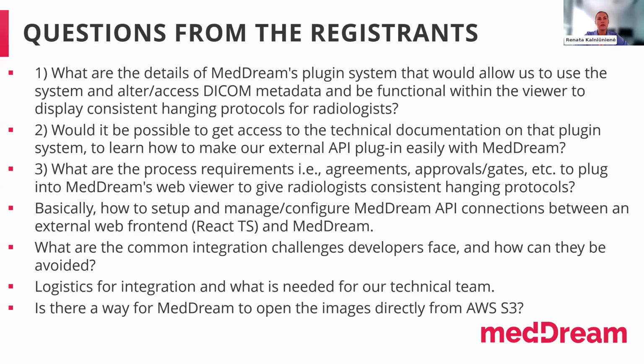So another question: what are the process requirements, agreements, approvals, gates, etc. to plug into MedDream's web viewer to give radiologists consistent hanging protocols? I would say it's a similar answer to the first question. MedDream has its own hanging protocols. So you can check them, you can use them, you can create your own hanging protocols on the MedDream interface, or you could use this communication API to build the views you want yourself. So it's up to you.